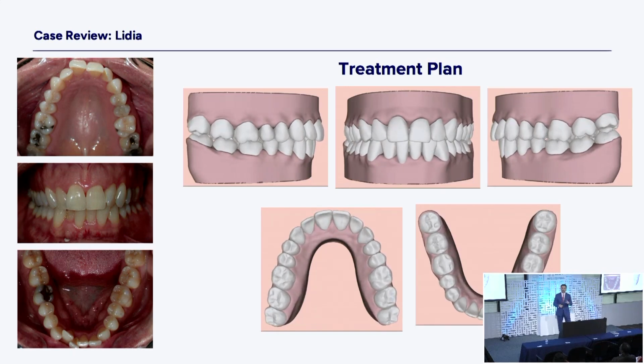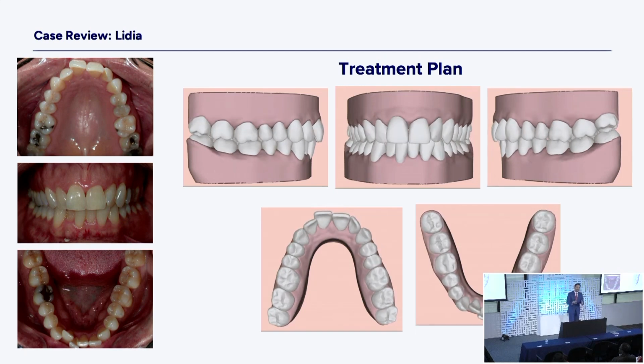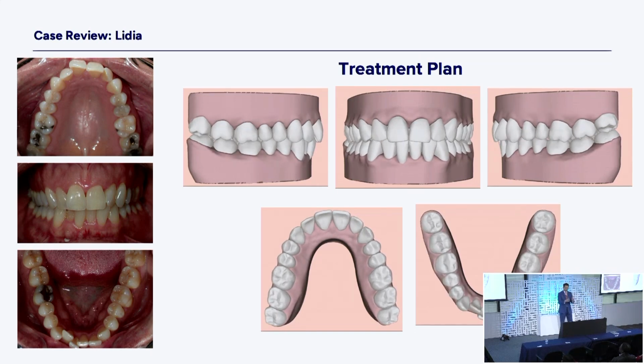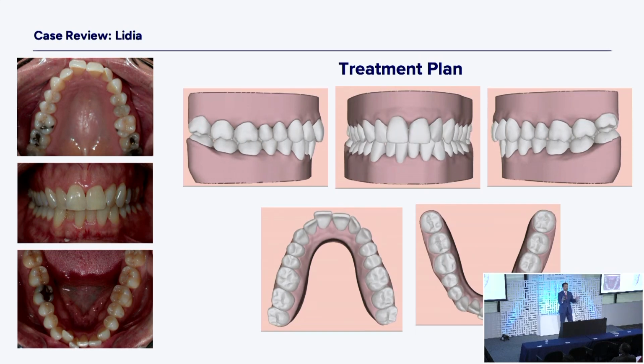Back teeth wider, front teeth forward. While I'm watching my video, I tend to look at the upper arch first. So the lower left movie is the upper arch. I want to see that the upper arch has the back teeth getting wider and the front teeth going forward. That's how you get rid of crowding.